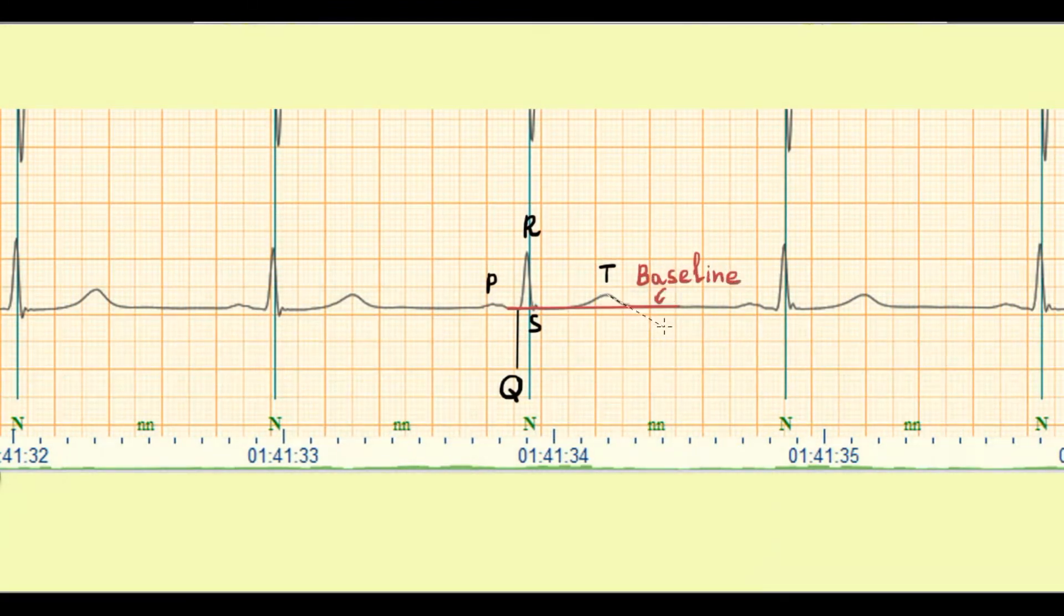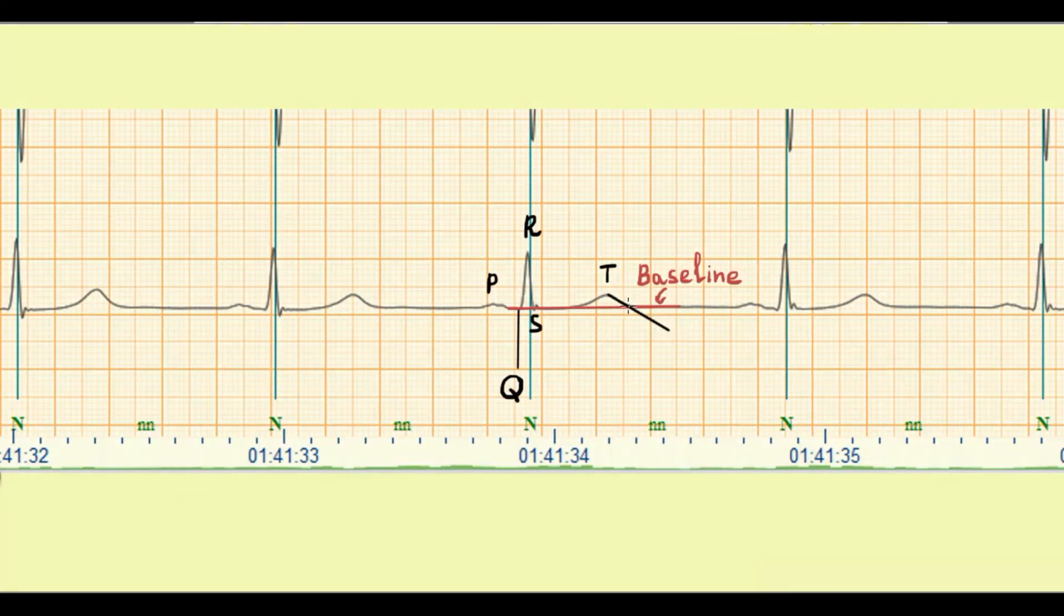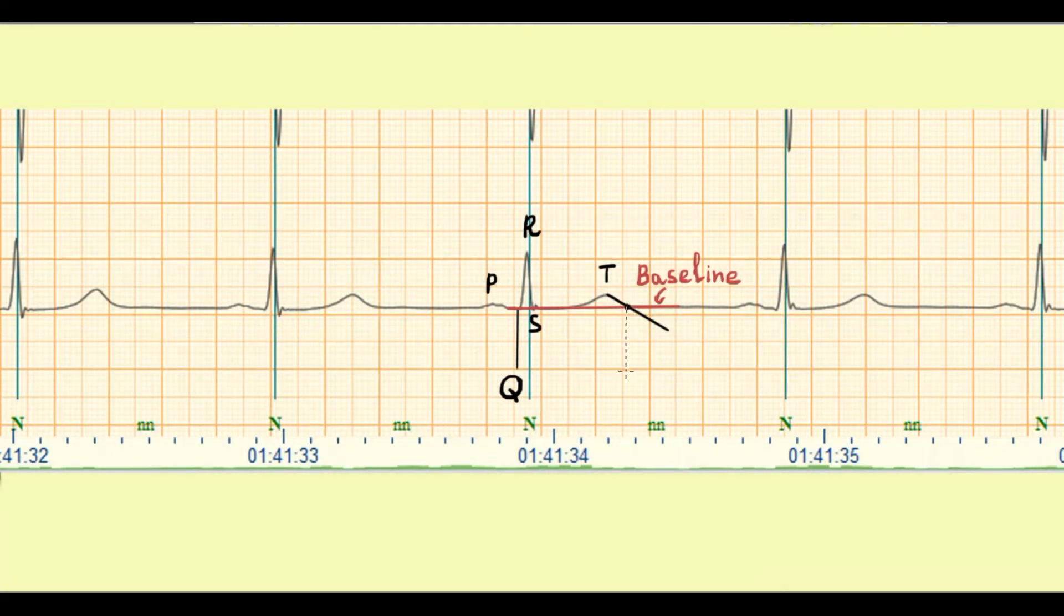Then, draw the second line along the slope of T wave. The place where the drawn line intersects the baseline, it is end of QT interval.